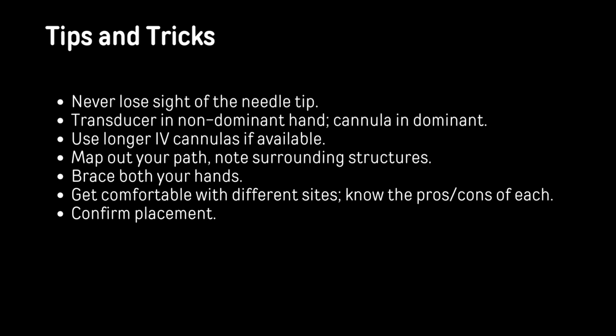You know that transducer, non-dominant hand carrying and dominant. Look, if you're doing a central line, that's long enough. But if you do a peripheral line, I must be honest, if you're not doing it on the superficial veins, like I've tried to use a green on the deeper veins, they come out. They're just not long enough. So I wouldn't put that in if you're going into the deeper tissues.